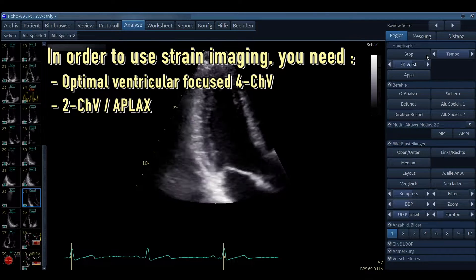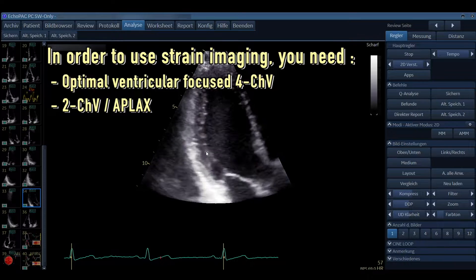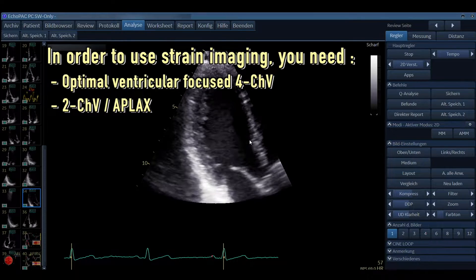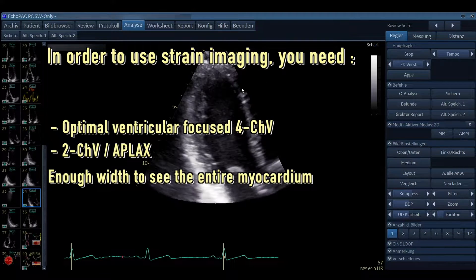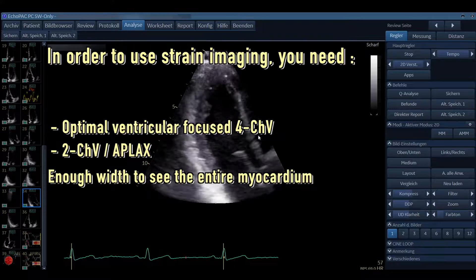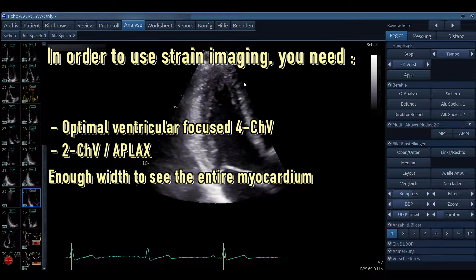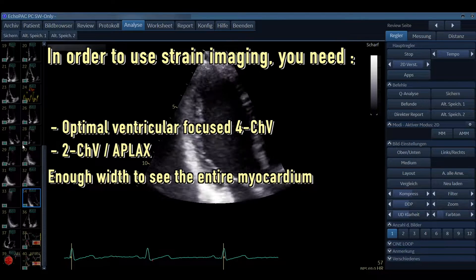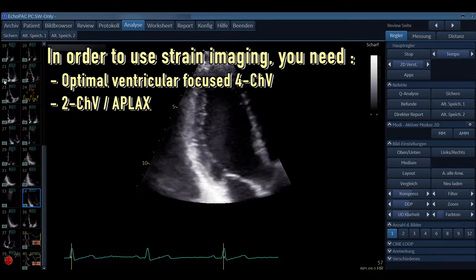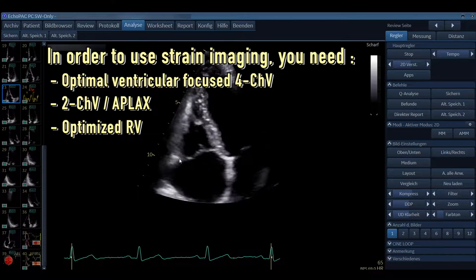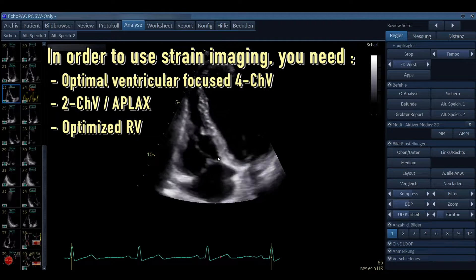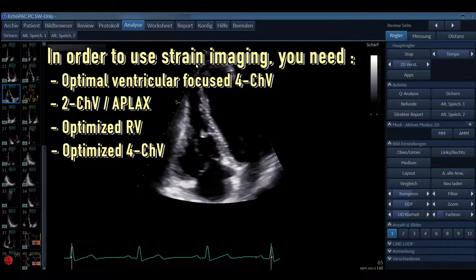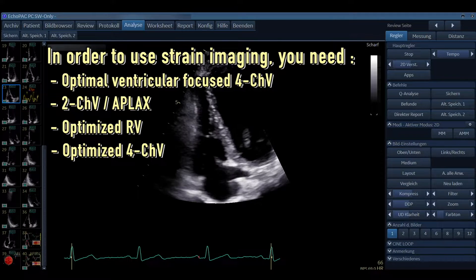Always keep in mind that views have to be as optimal as possible. When you don't see the endocardial borders, the machine will also have a problem seeing them. Always be aware to make the width broad enough that you really see the entire myocardium — if it's a little bit cut off, this is not an optimal view for strain imaging. In case of the right ventricle, you need an optimized right ventricular view, and also an optimized four chamber view to delineate the free wall of the right ventricle.